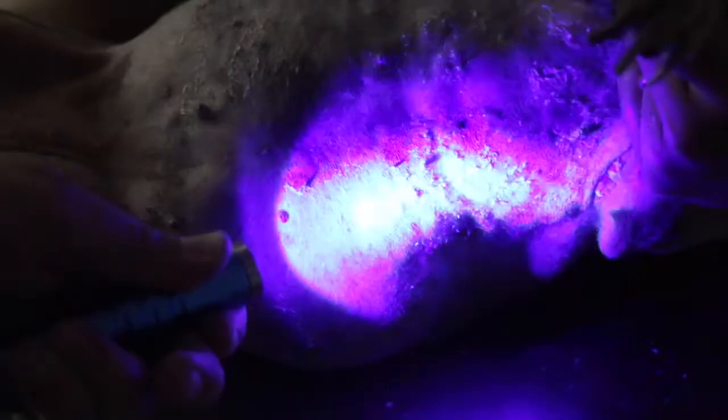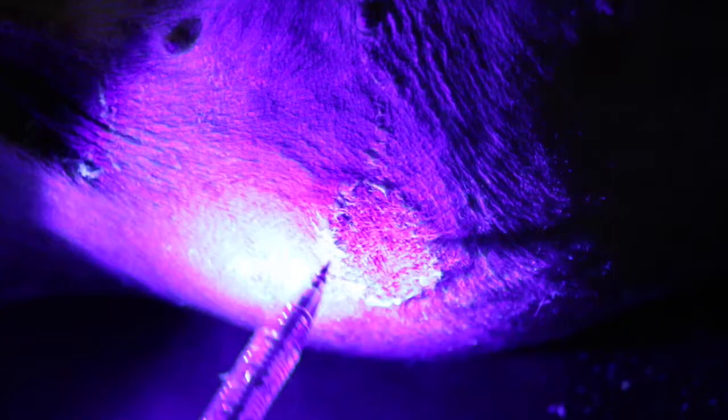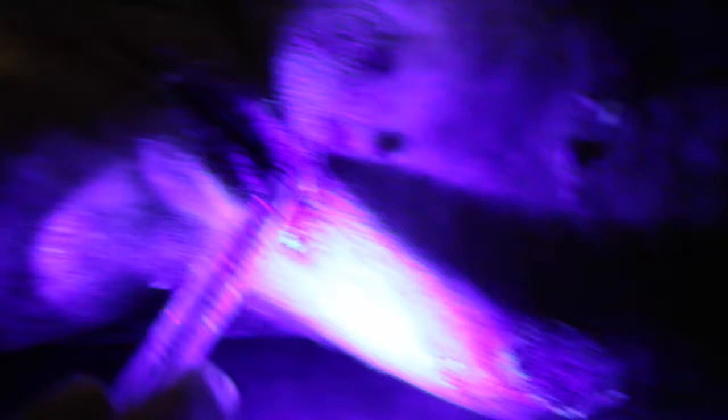In this last example, you can see that the cameraman is filming another case of ringworms, as you can see by the circular lesions. The good thing about this video was that the camera was able to focus on the fluorescent areas very clearly. You can see that the fluorescent glows bright and the camera was able to capture everything the vet needed for the owner to see. Though the UV light overexposes most objects when it shines upon them, the camera was able to constantly focus without any issues, as the cameraman followed the vet closely. The vet also cooperated by moving a bit slower than usual, therefore allowing the camera to capture it and show the owner what had happened to the dog.